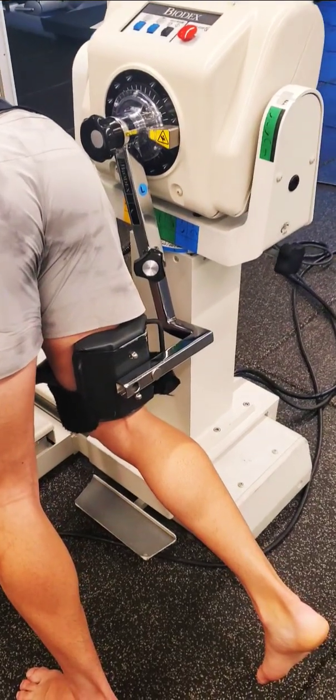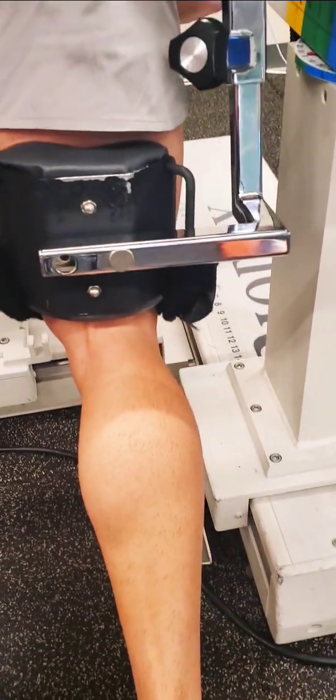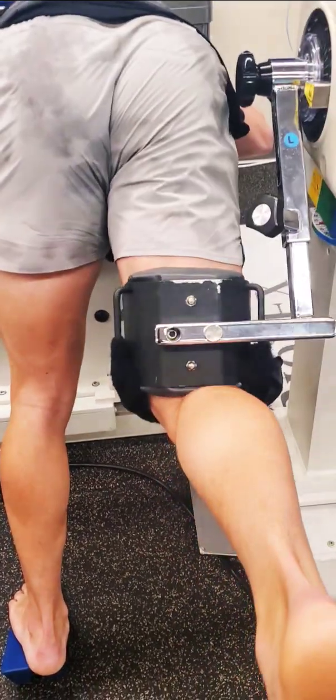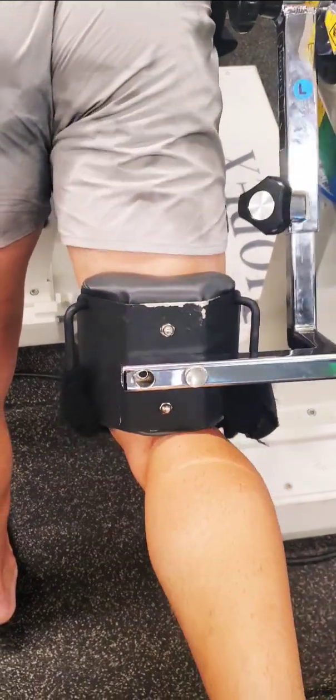The hip is going to be strapped in at approximately an inch above the popliteal fossa. If the patient goes through the full range of motion, you'll see that there's enough bandwidth there that it doesn't encroach upon their lower leg.